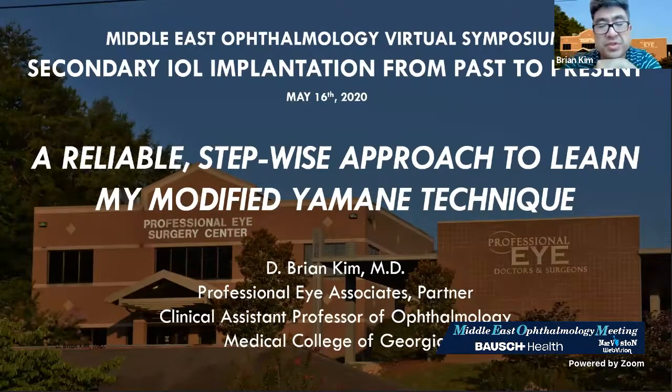That's just with experience, but I've seen some videos where doctors have been marking with an ink pen 2 millimeters from the tip of the needle. My only concern with that is putting that ink into the vitreous space. But the few surgeons I talked to who did that said they didn't have any complications. So I think it's not a bad idea to ink it, but my warning would be to make sure the ink is dry before you place it into the vitreous space.